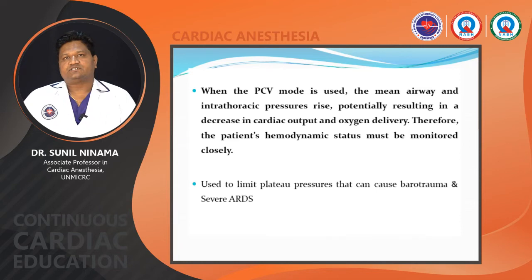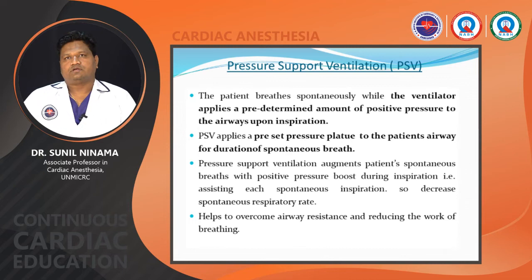Therefore, the patient's hemodynamic status must be monitored closely, and used to limit the plateau pressure that can cause barotrauma in severe ARDS. So in this mode, you always have to look for the plateau pressures also.